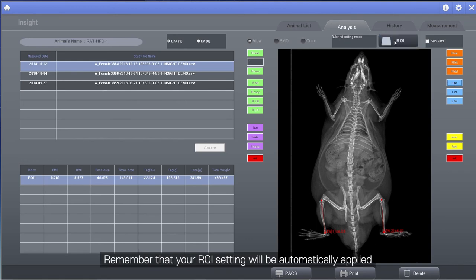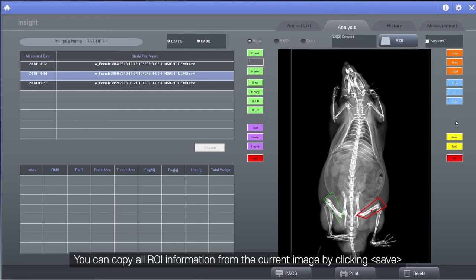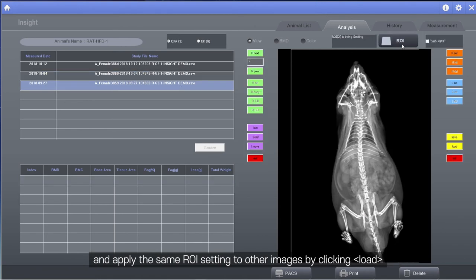Remember that your ROI setting will be automatically applied once you re-click ROI button after ROI setting. You can copy all ROI information from the current image by clicking Save and apply the same ROI setting to other images by clicking Load. You can apply the loaded ROIs by modifying them accordingly.